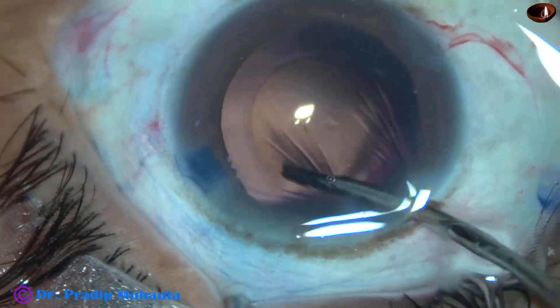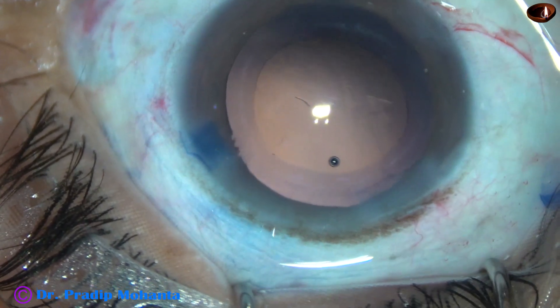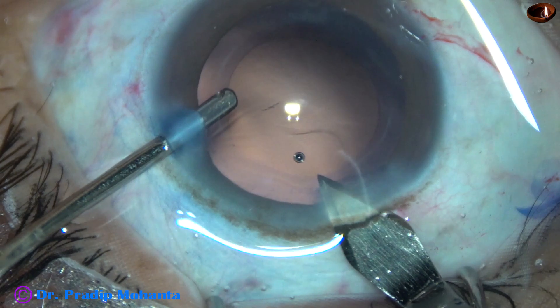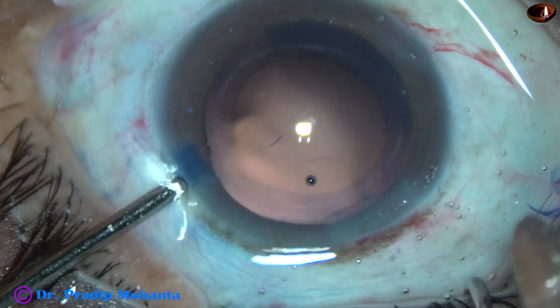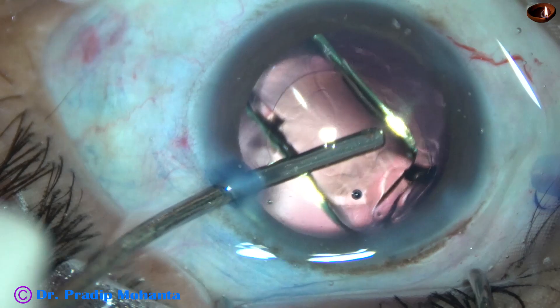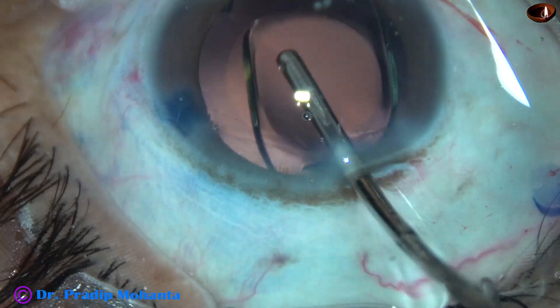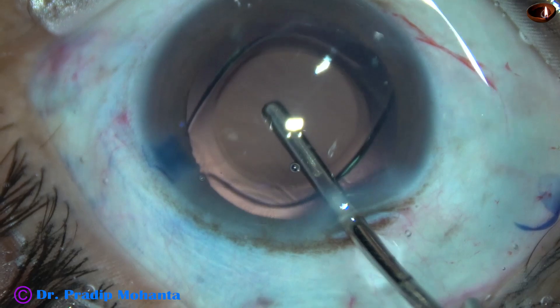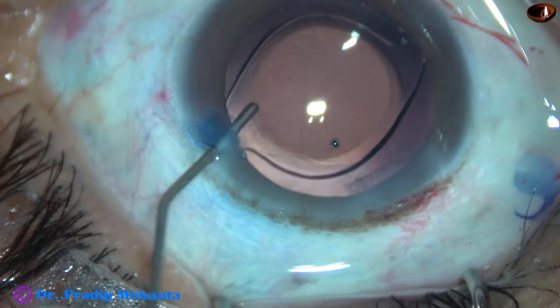This is hydropolish — just by irrigation, the lens fibers sticking to the posterior capsule are removed. And now I am going to implant a hydrophobic acrylic intraocular lens through a B-cartridge. That's how I have enlarged the main incision a little bit, so the main incision is now about 3 mm. This is a hydrophobic single-piece monofocal intraocular lens. Since the size of the rhexis is about 5 mm, the optical part of the intraocular lens is covered all around by a rim of anterior capsule.